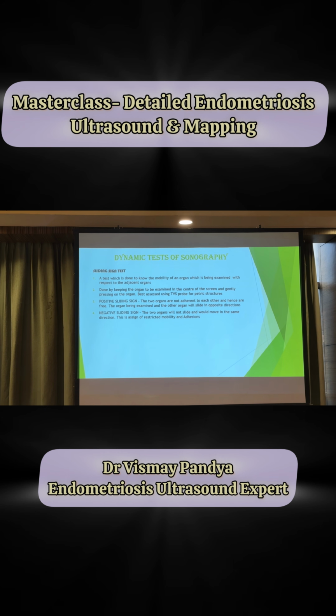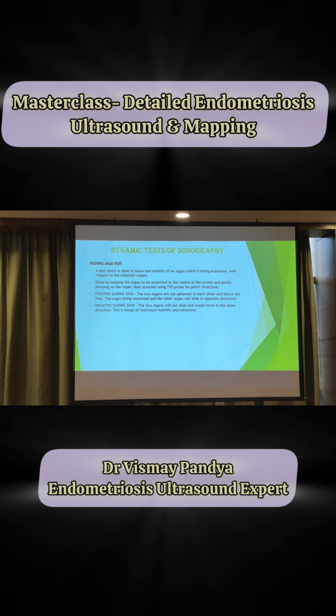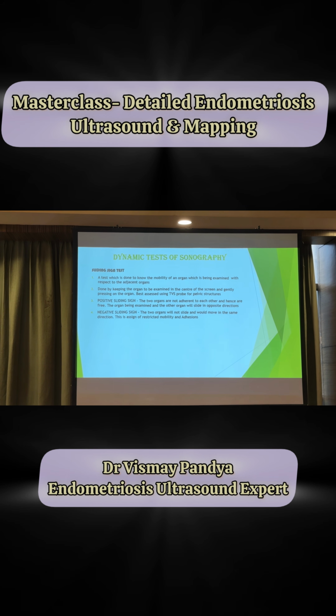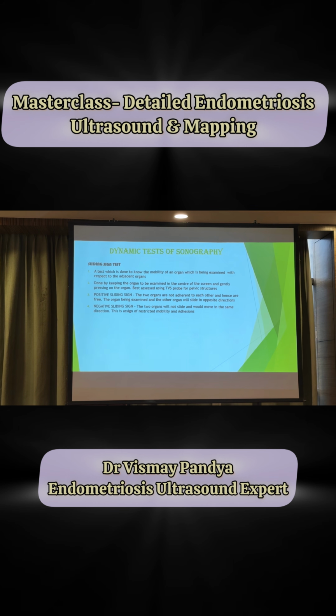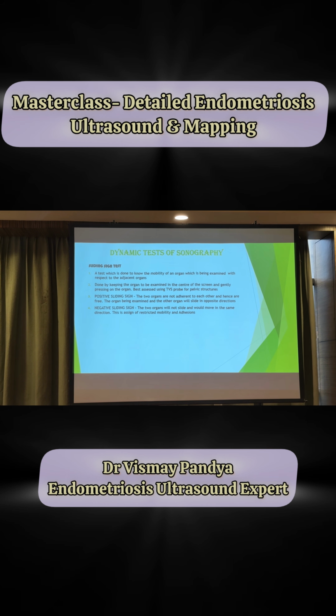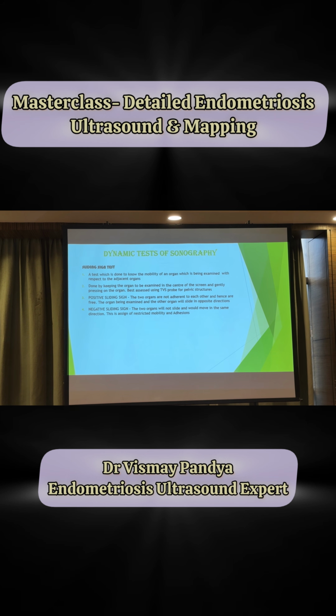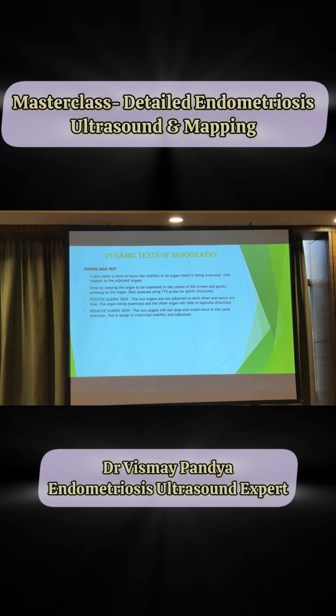So coming to the dynamic tests of sonography. The first test is the sliding test. It is a very basic test which can be done on any two structures transvaginally. You just put the probe and centralize those two structures. It could be the ovary, the uterus, the rectum, anything.